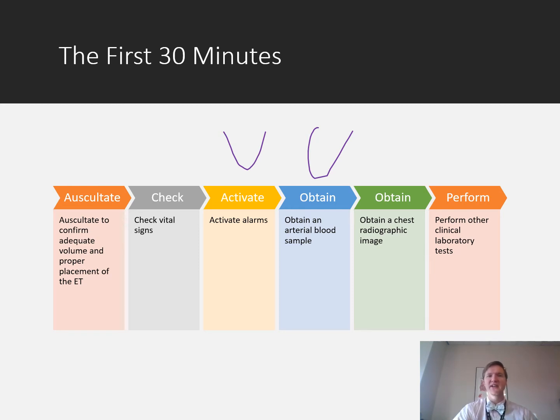The key point here is to understand and remember that positive pressure ventilation can reduce venous return to the heart, right? We're restricting the vena cava with all that positive thoracic pressure. So your cardiac output could go down, your blood pressure could go down. As a result, your heart rate probably goes up. So if you see blood pressure go down and heart rate go up, odds are that that PEEP change that you just went up on is causing a restriction and causing a reduction in that cardiac output without even having a cardiac output monitor in place.